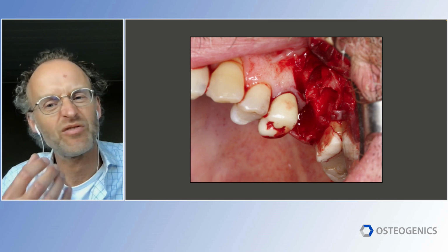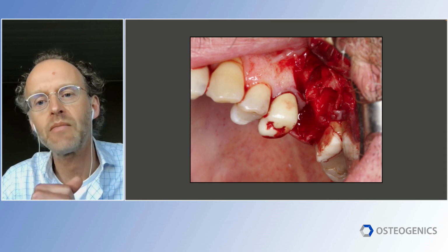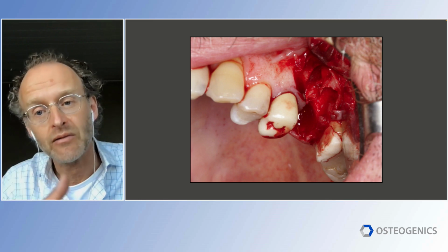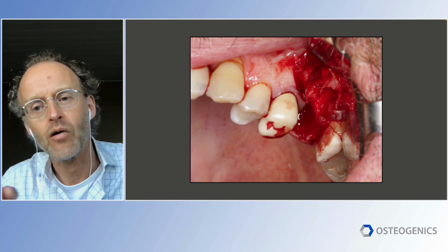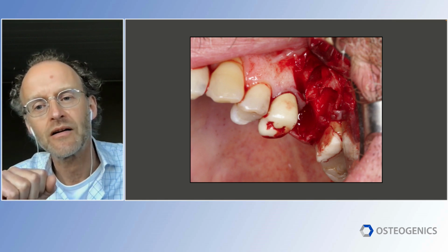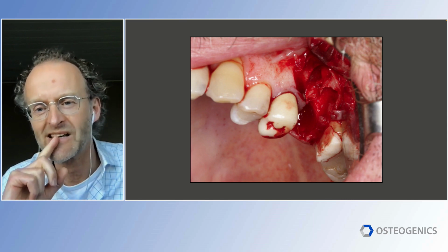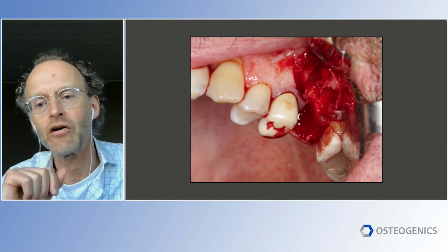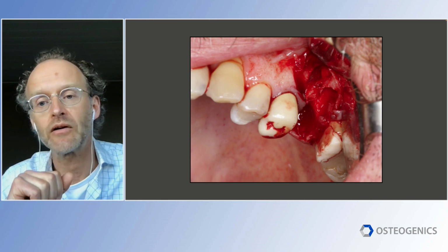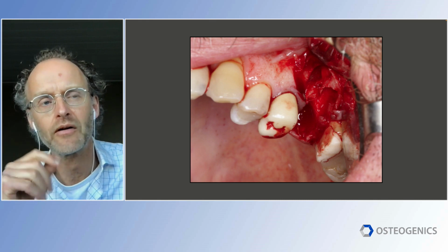You take out a very weak molar tooth. It breaks off. Roots are remaining. You have to lift the flap and remove bone because you want to have access to the remaining roots to get them out. And while you're drilling away the bone around these roots, probably you also have noticed there's a little voice in the back of your mind saying, I don't like this really. I am moving away the bone, which I have to restore later on. Probably a familiar feeling, your thought.